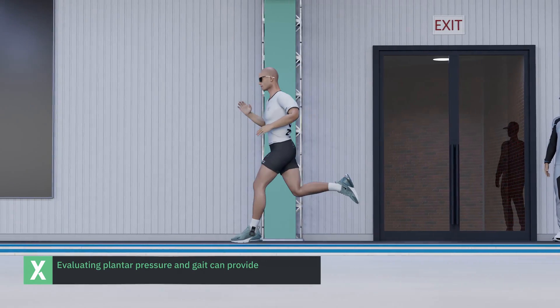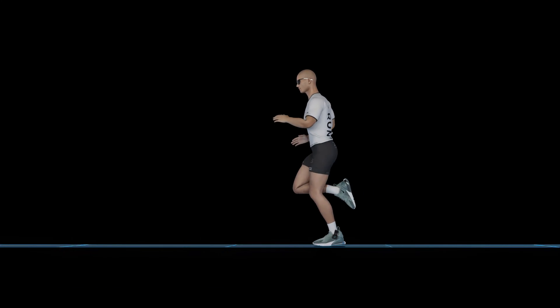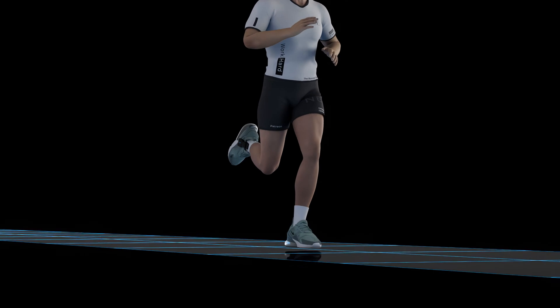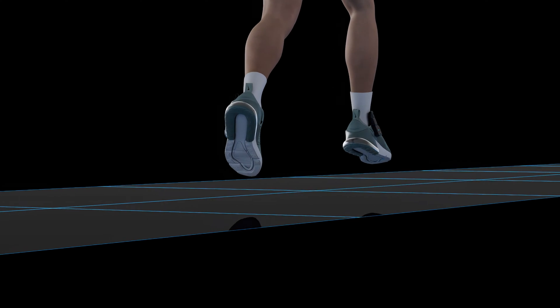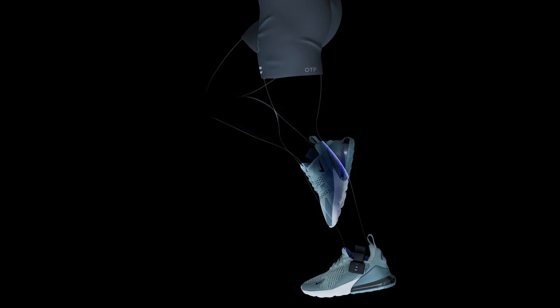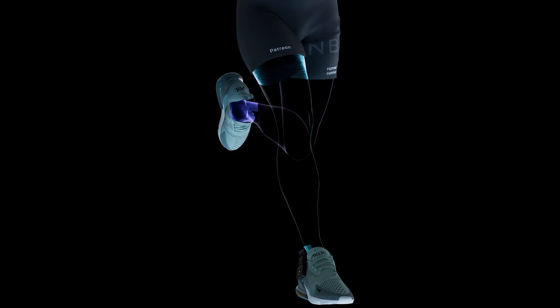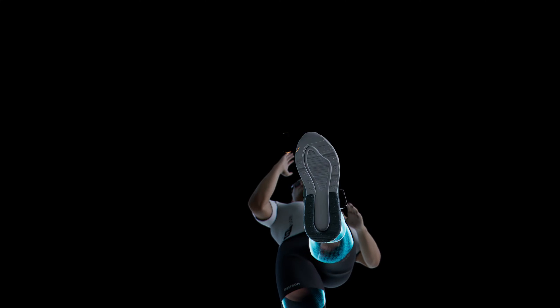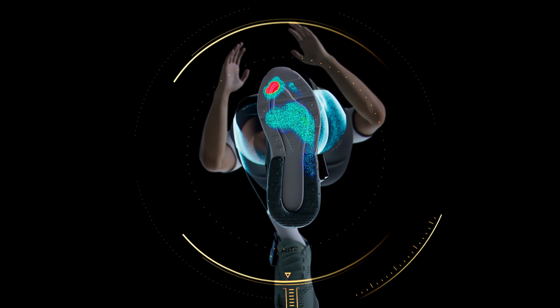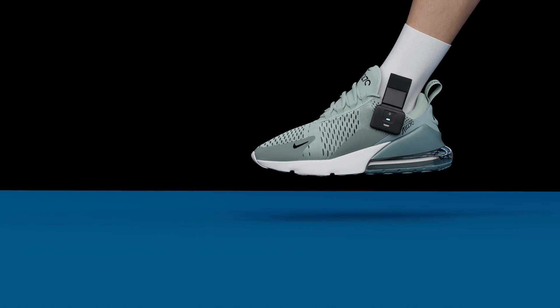Evaluating plantar pressure and gait can provide critical insights into optimizing human performance. Whether you are a coach tracking the body dynamics of an athlete, a clinician trying to improve the foot function and mobility of a patient, or a footwear designer creating the next breakthrough running shoe, you are missing out on crucial information.